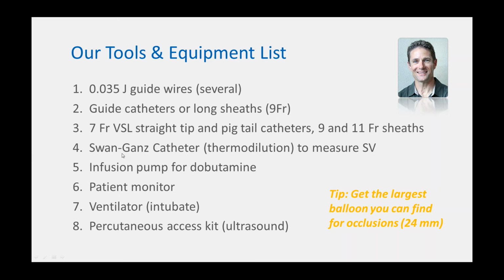In all of our models, we always stress the animals with dobutamine, so we use an infusion pump to be able to control those rates. We measure our physiologic parameters with a patient monitor, and we use one that would be found clinically, simply because we can offload instantaneously from this particular monitor right to our computer, so we can record all of our data digitally. We always ventilate our animals and generally intubate them.